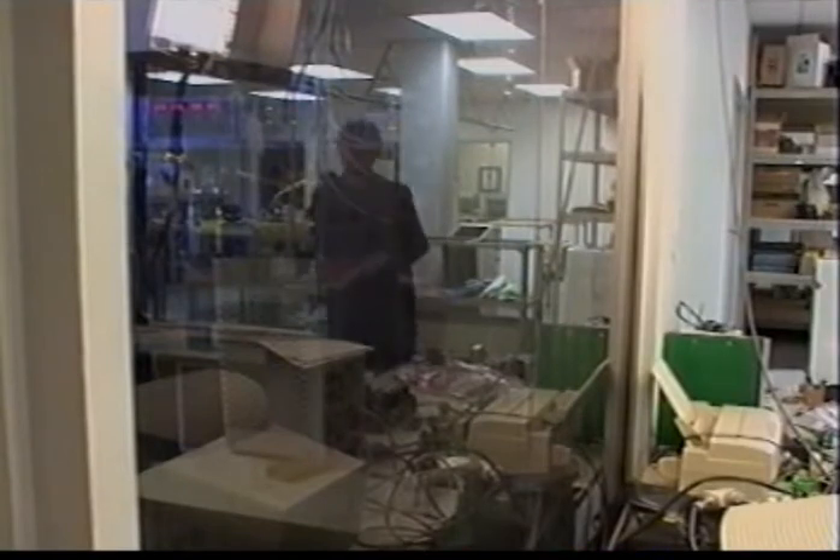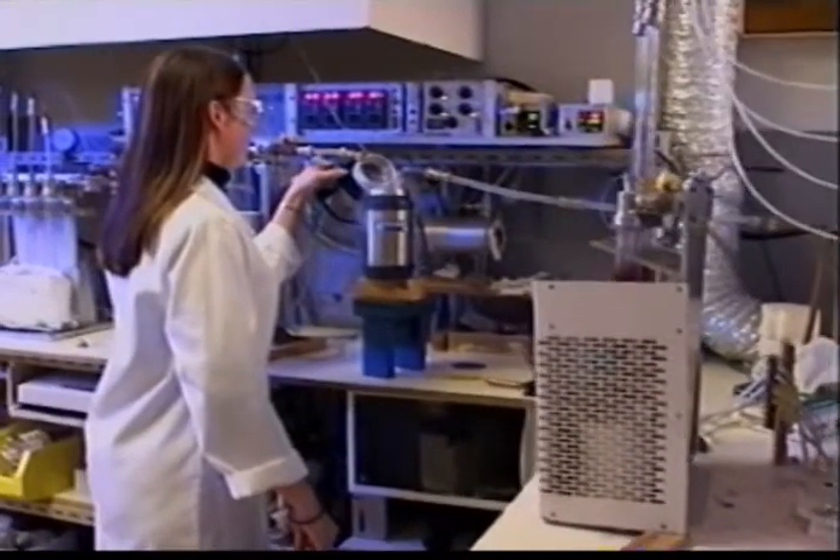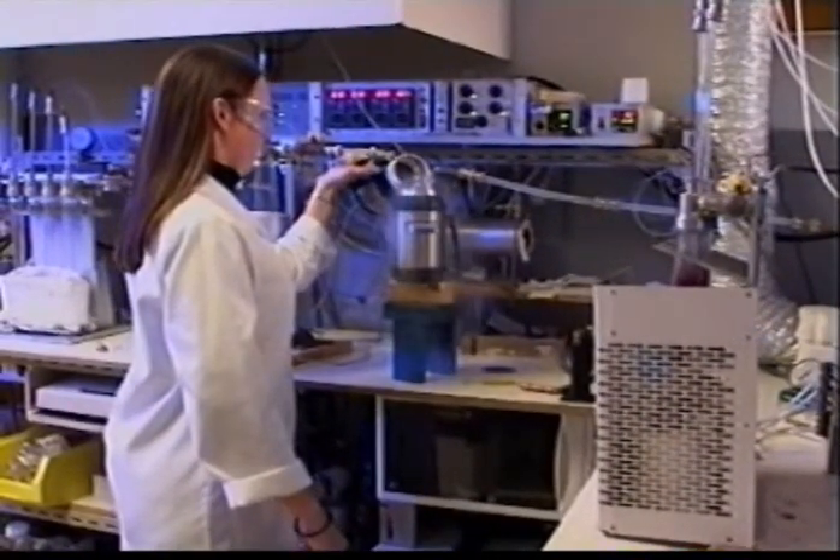The copper bromide chemical used to fuel the laser tube is processed and purified in a small chemical laboratory to prepare it for inclusion in the system.